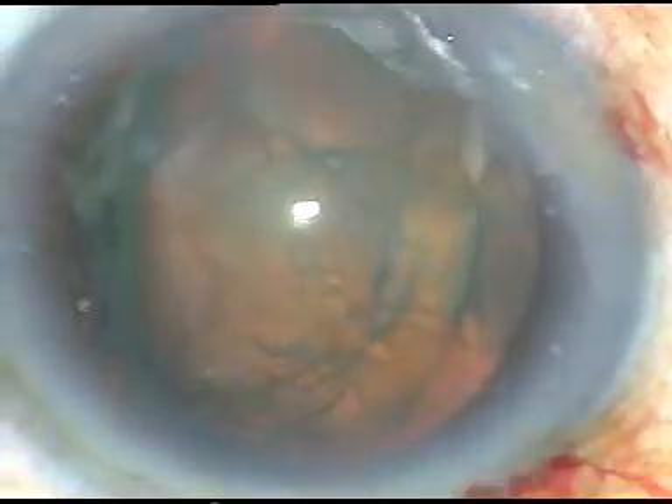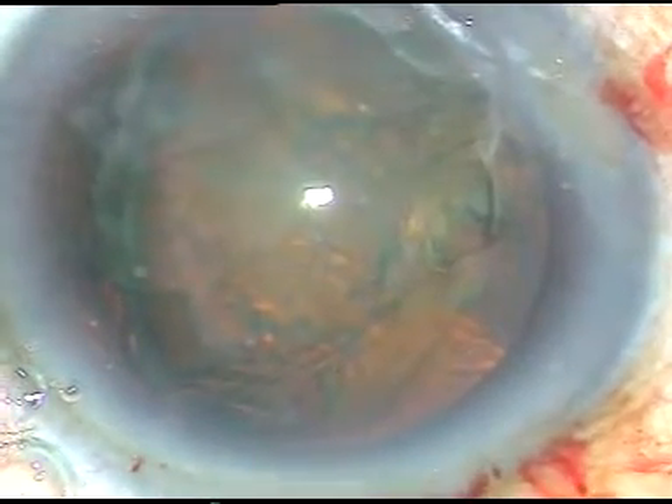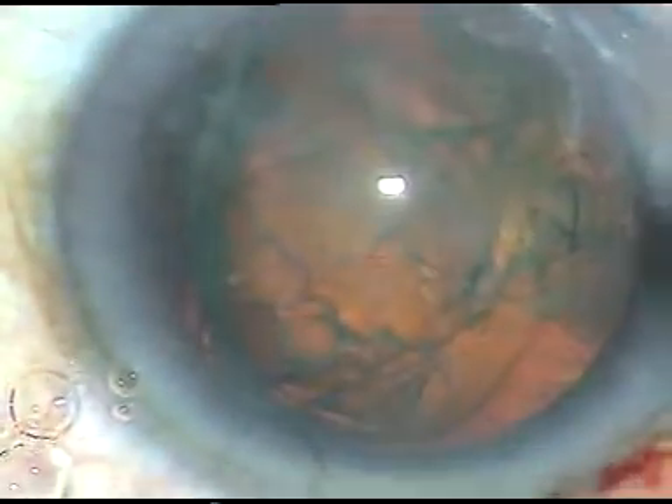Now I will inject some viscoelastic substance on either side of the prolapsed nucleus — this is on the left side, this is on the right side. Now I will introduce a chopper through the side port and support the posterior surface of the cataractous lens. I will approach through the other side, from the anterior side, and the bevel of the phaco tip will face the nuclear mass.